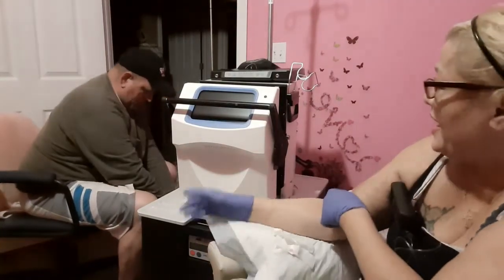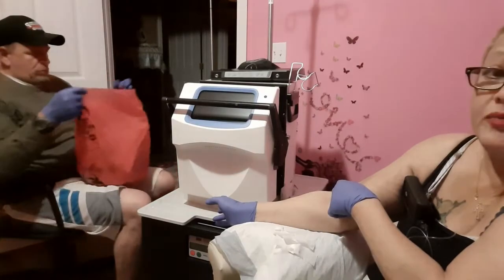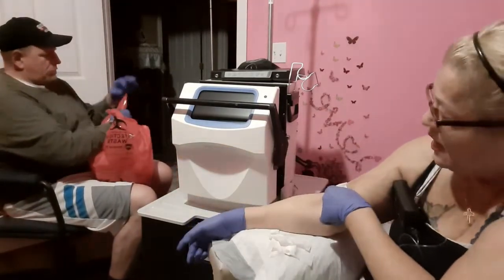Hobster's removed all the bags. He's opened the cycler. Of course, the warmer is unplugged. He's put everything in a biohazard bag.